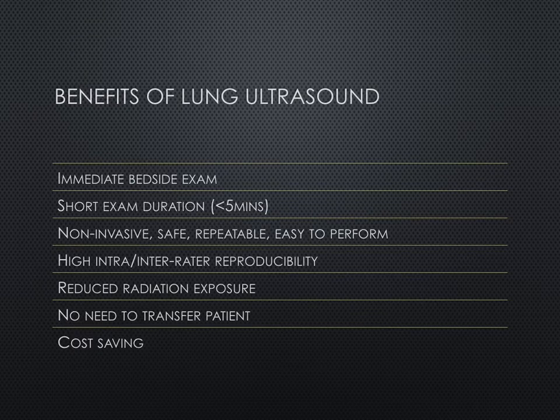Just as an overview, the benefits of lung ultrasound. Lung ultrasound is fantastic. It's one of the most practical and useful imaging techniques we have within the critical care, acute care environment because it's very hands-on. It's an immediate bedside exam that we can do. It's relatively short in duration. It's not like a really long and complicated cardiac exam that you might be doing to identify pathology. The actual assessment can be done relatively quickly at the bedside itself.